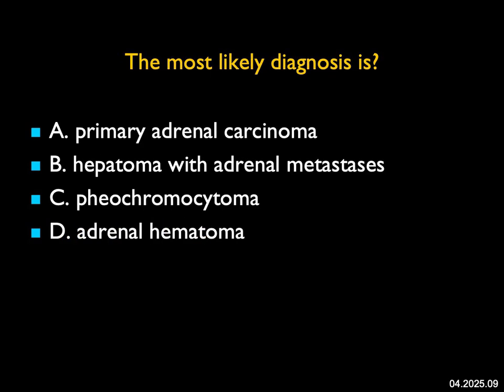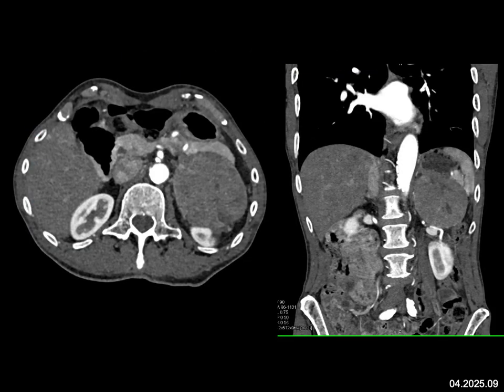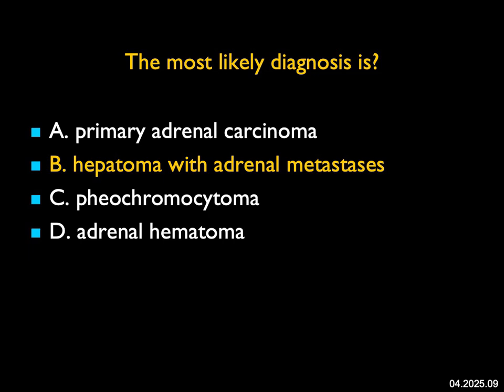The most likely diagnosis in this case — two findings. The first is an obvious large mass in the left adrenal gland. If that were my only finding, I would say primary adrenal cortical carcinoma. But you also need to consider a pheochromocytoma or an old hematoma. However, when you look at the liver carefully, particularly on the coronal views, you can see an infiltrating process. The liver also looks cirrhotic. Adrenal cortical carcinoma can metastasize to the liver, but when I see a cirrhotic liver with a liver mass and then an adrenal mass, my best diagnosis is hepatoma with adrenal metastasis — which was the correct answer.